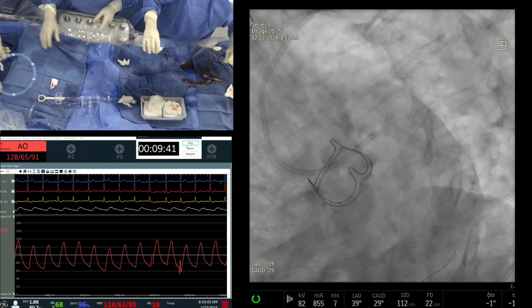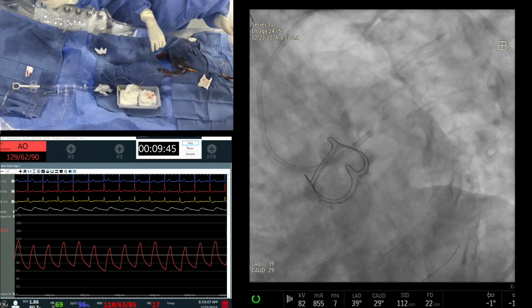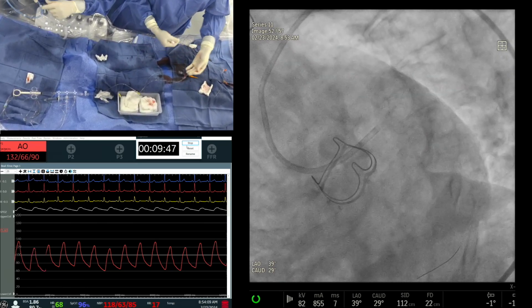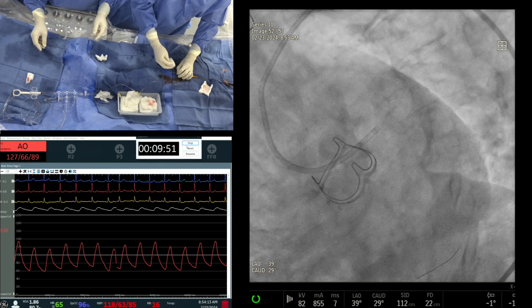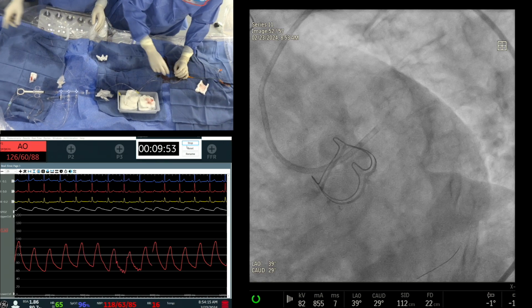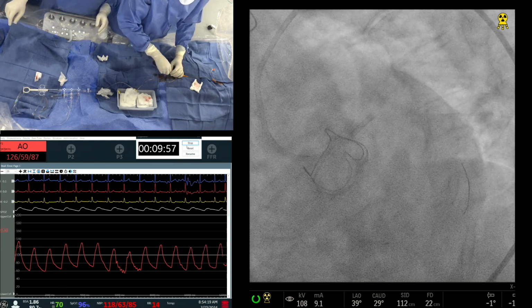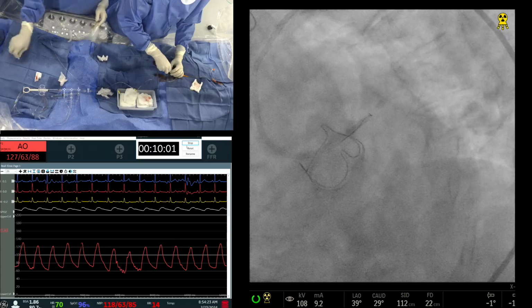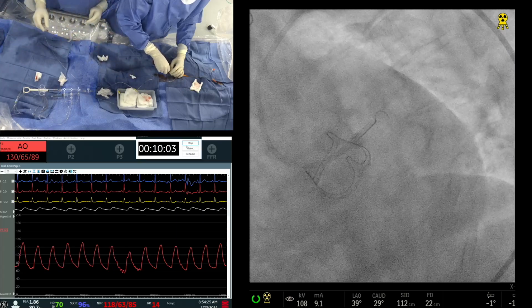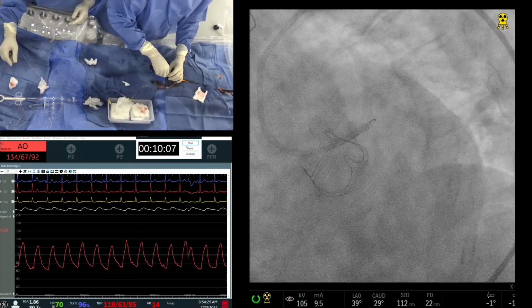Okay. And I think you want to put a burr in the LAD? LAD, yeah. So we'll get a 2.0 burr now. We'll attach it and see if we can move it. Otherwise, we'll go with the same strategy. Get the IVUS. Here's the clip. So you sometimes use a torquer as a clip necessary, because usually we don't use much in terms of the torquer.